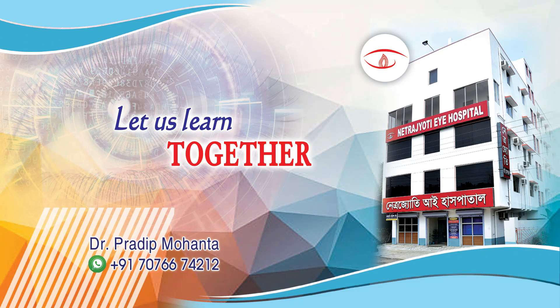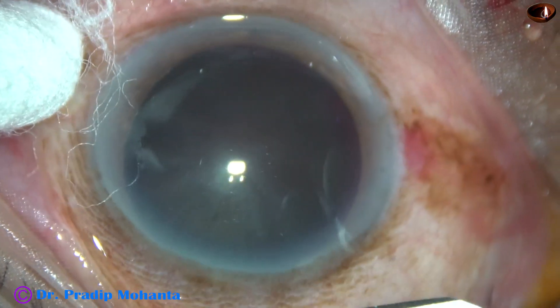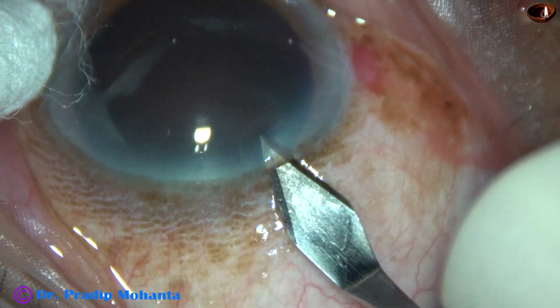Friends, welcome to my workplace at Ranaghat, West Bengal, India. This is the hardest cataract that I have managed in the last six months by phacoemulsification. Let us observe this surgery.